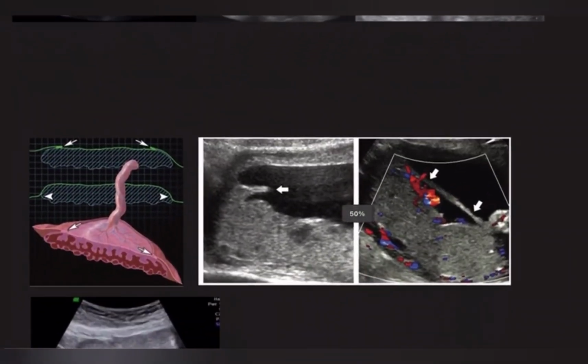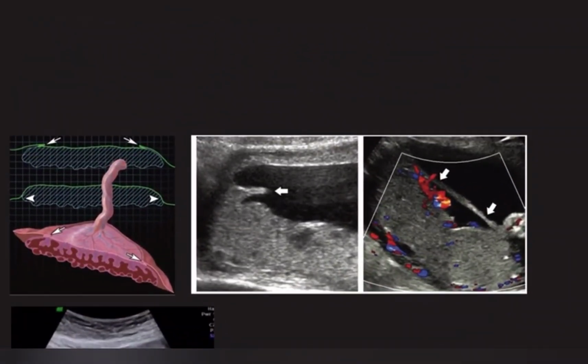The third differential is actually the circumvallate placenta. Why does circumvallate placenta form? We already know that one is the basal plate and one is the chorionic plate. When the chorionic plate, which is facing the fetus, is smaller, the membranes which cover it are redundant, and they form shelves along the edge of the placenta. When we move the probe, we can see linear echogenicities attaching from one placental edge to another placental edge. It will be parallel to the orientation of the placenta. So now we know where it attaches. It attaches placenta to placenta, and they are usually thicker in thickness.